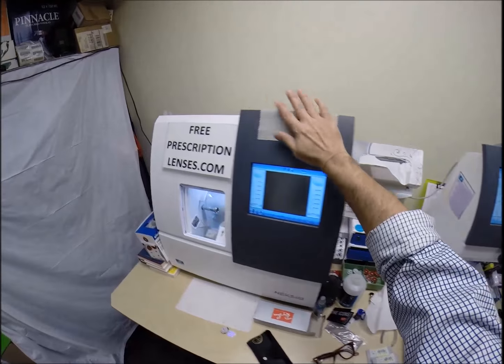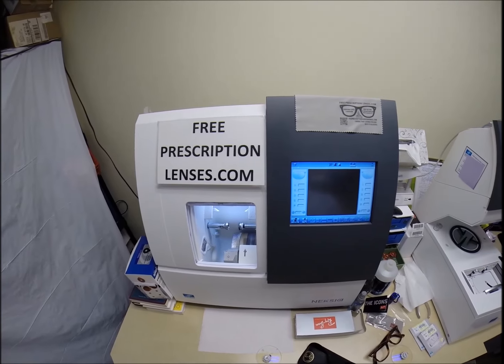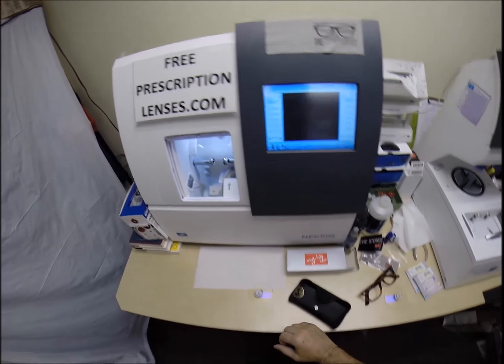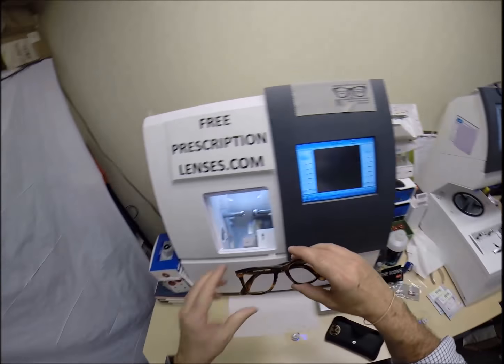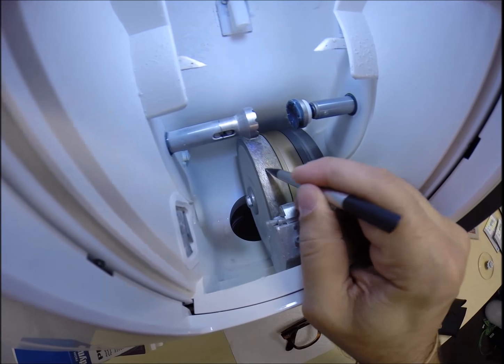Now this is the edger. This is what's going to do all the work while I run my mouth. It costs $40,000. It weighs 200 pounds. I recommend everyone go out, buy their own, put it on your kitchen counter. Then you can cut your own RayBan lenses at home, and you won't need this guy anymore to do it for you. So the actual cutting wheel is this heavy grit wheel here.